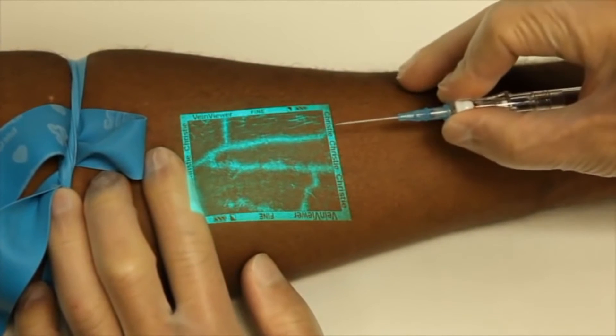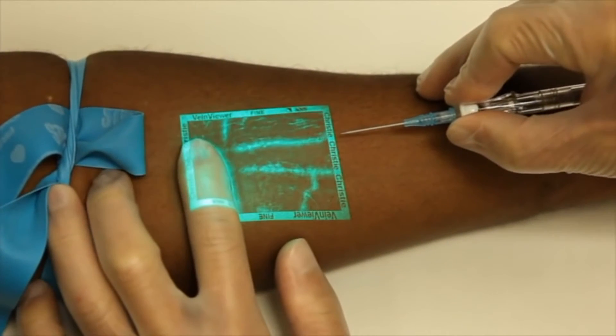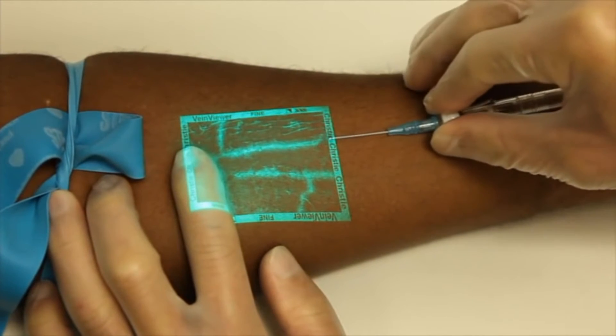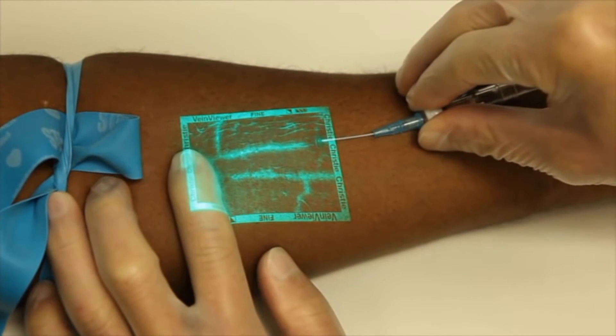VeinViewer provides a solution which allows you to not only find a vein, but to find the optimal vein to access. That goes beyond the human eye and far beyond the needle stick.